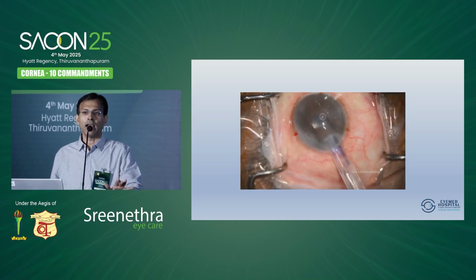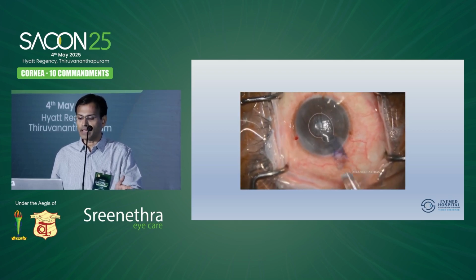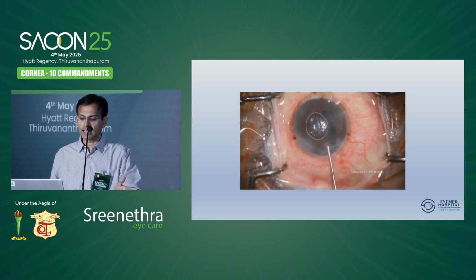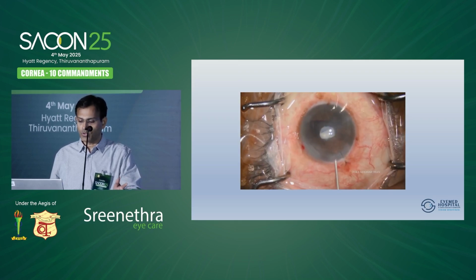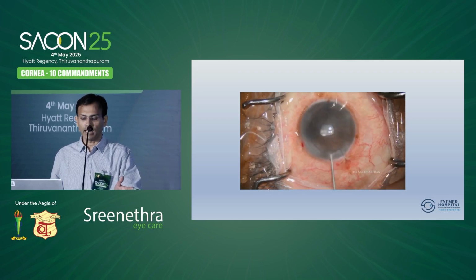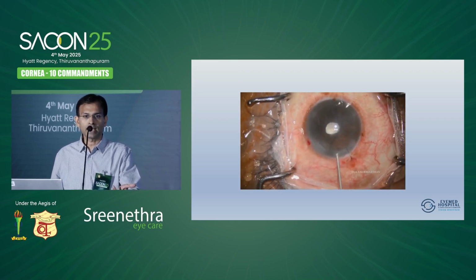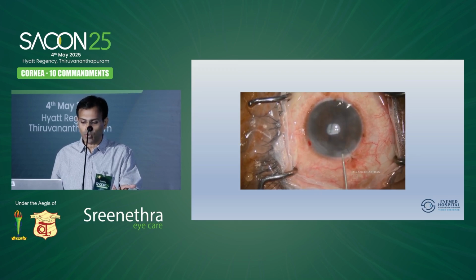So when you are doing it, there can happen this piecemeal tear, all these tears can happen. And initially, this is 2013, when you didn't know how to even inject it into the anterior chamber. And doing all these things, there is a loss of cells. And you see here, there is no mark in the endothelium. We did not know how to unfold it, which side is endothelium, which side is the Descemet's.